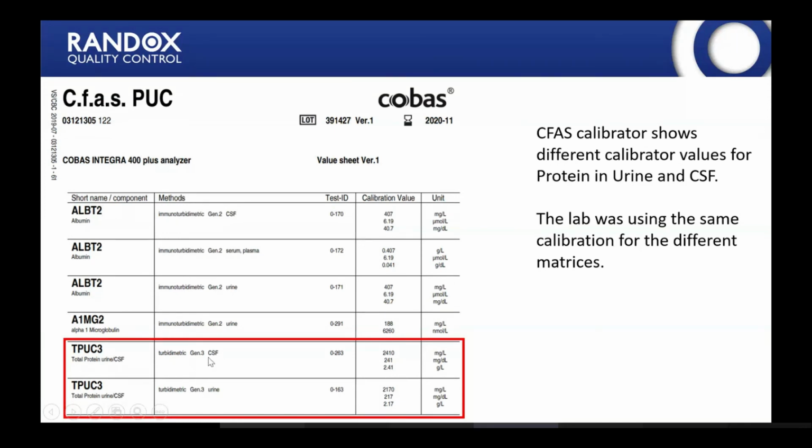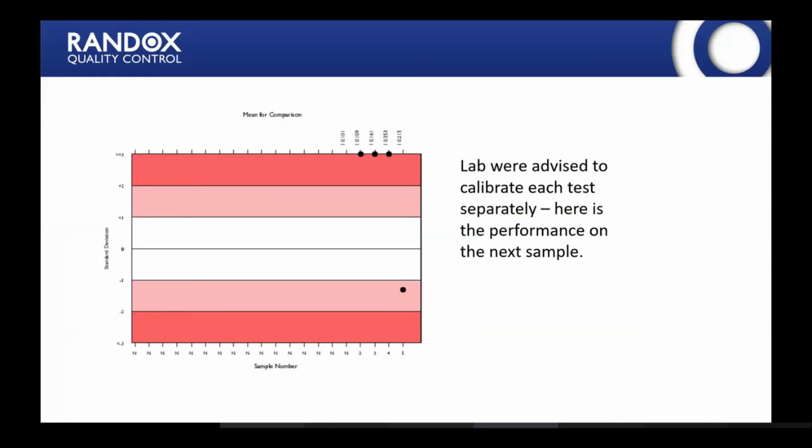So as you can see, there are two values, one specifically for CSF and one for urine, and they do have different calibration values. And that's basically it, they were using the one value for both. So instead of using the two, they were using the one. So this is why they showed the positive bias for the urine program. So the labs were advised to calibrate each test separately, and there you go. Once they changed that, their performance improved dramatically, as you can see in their latest report, latest sample.